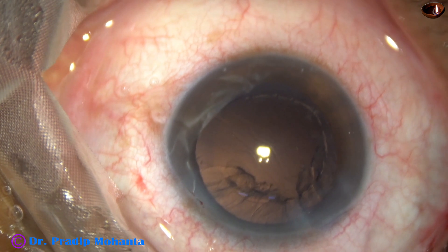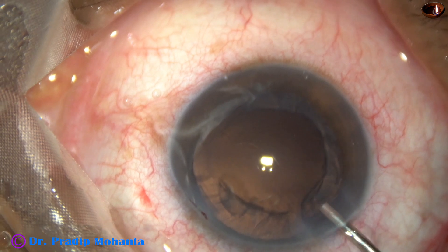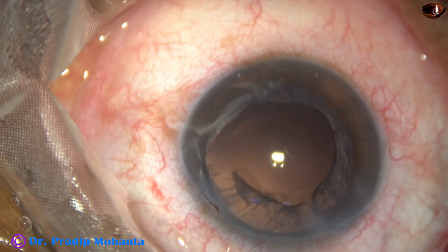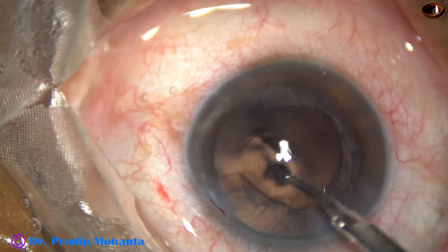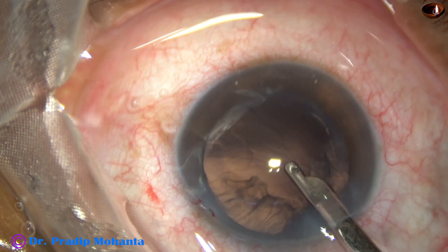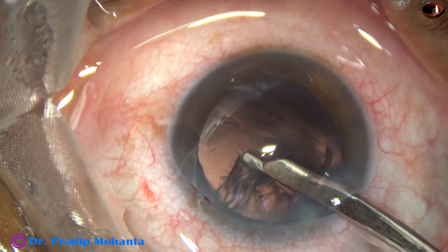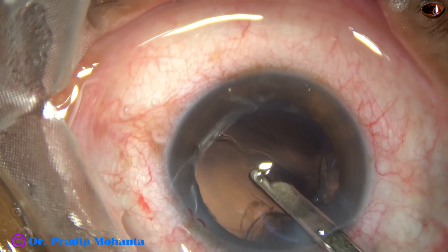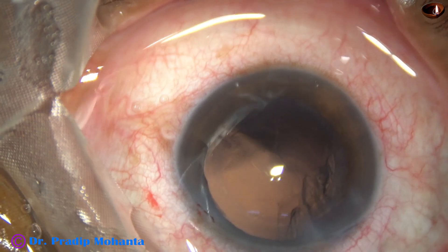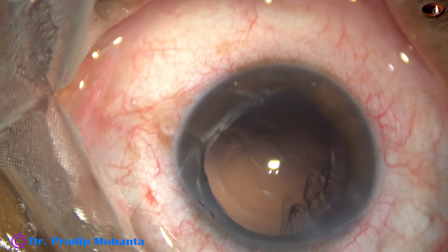Now we have some cortex in this case. A little bit of viscoelastic is used to fill up the anterior chamber and then a Simcoe cannula is used to remove the cortex. Beginners are familiar with Simcoe from their SICS training and there is no harm in using this instrument in phaco surgery.